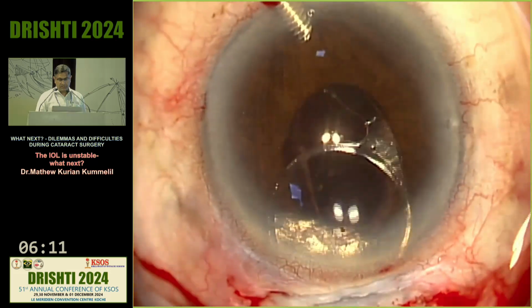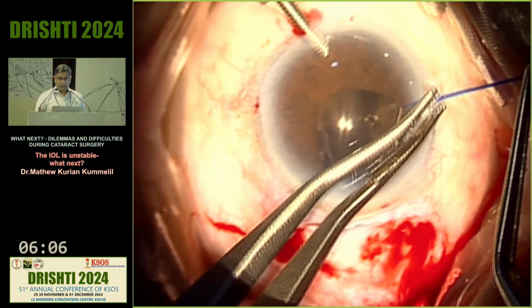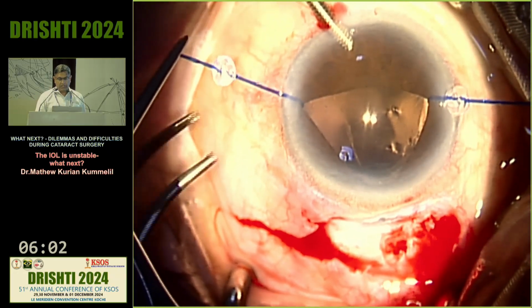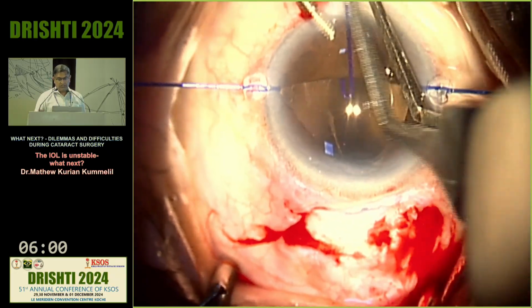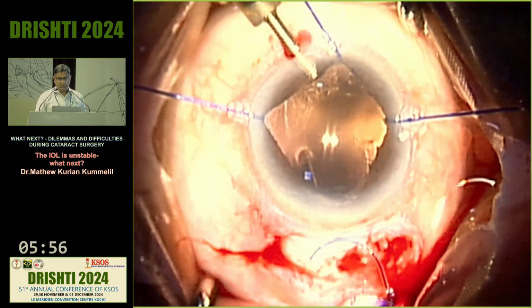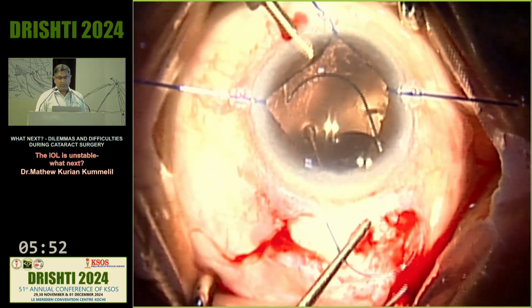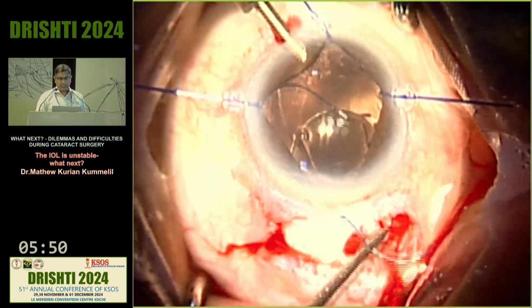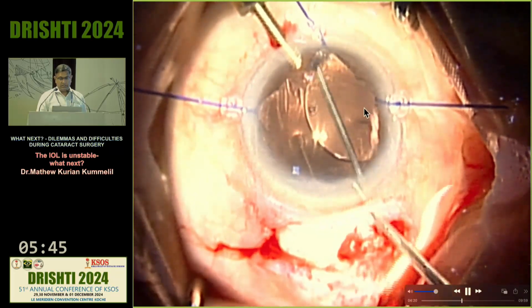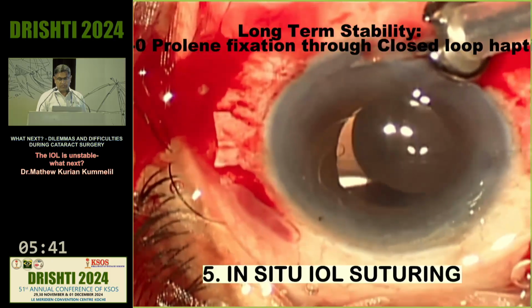Once the vitreous is cleared up, I want support, so hold the IOL and then explant it. And now I examine, I could have done this, I should have probably done this initially itself, use the hooks to see what exactly is causing the problem. I see adequate rexis support is there, and the rent is only a small central rent over there. I am able to place the rigid lens in the sulcus.